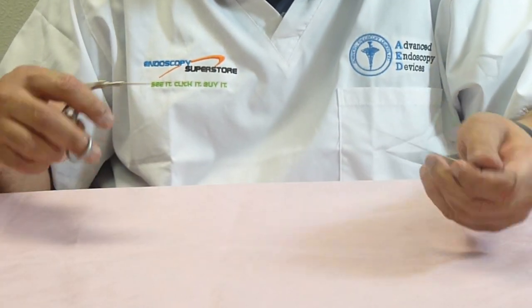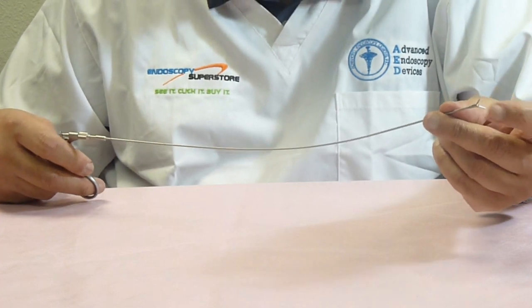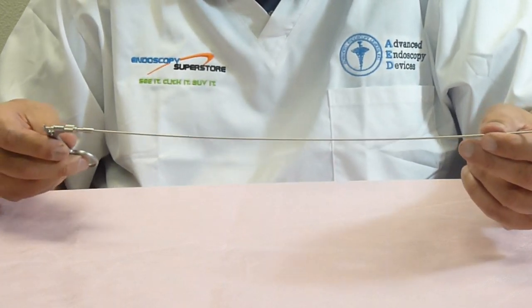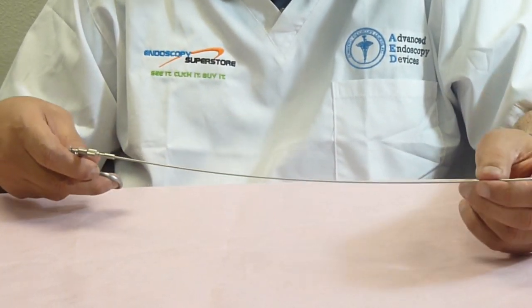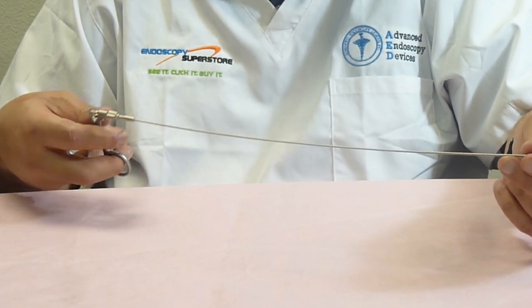We have many types of flexible forceps available. Flexible means that you can flex them in any different way you want. We have graspers, biopsies, scissors, and tenaculums. We have them in 9 French, 7 French, 5 French, and 3 French — so we have every single diameter you want. We have them in standard lengths, and we can make them in any custom length that you desire.